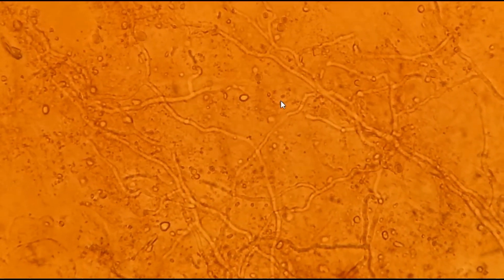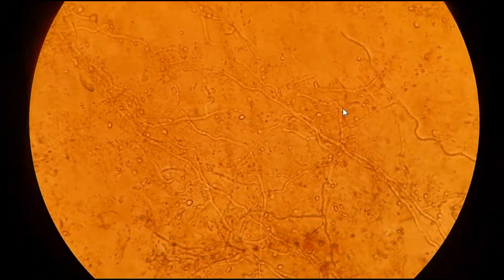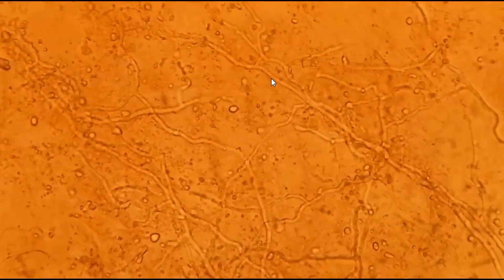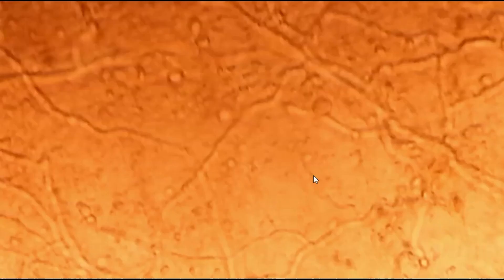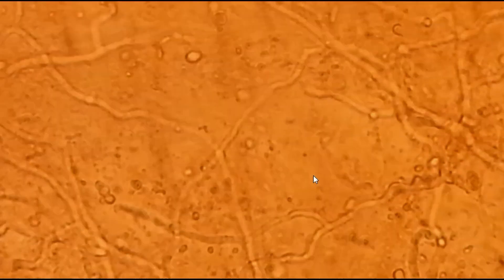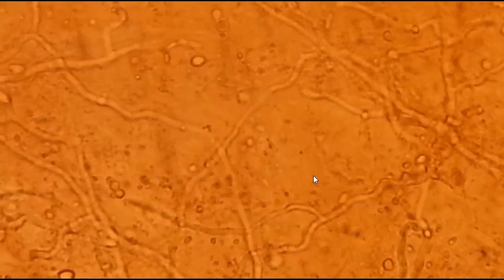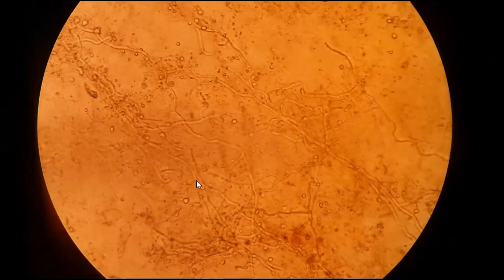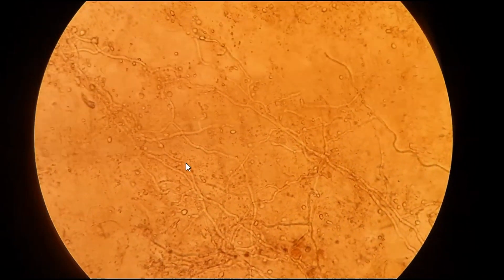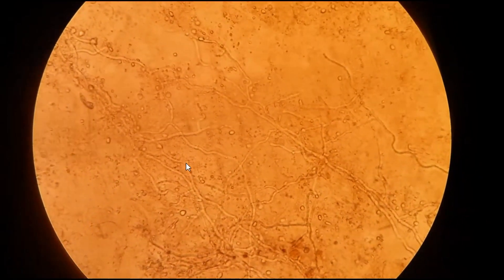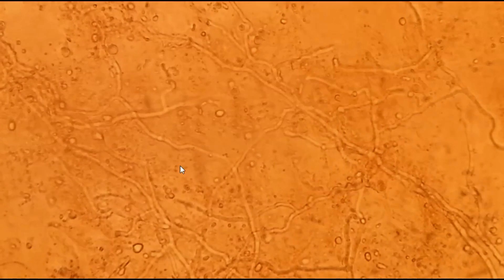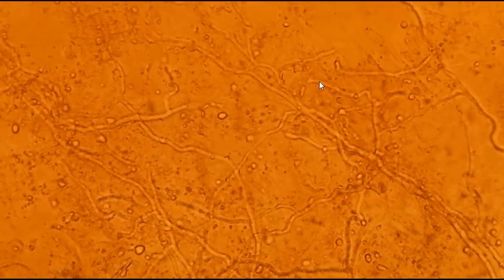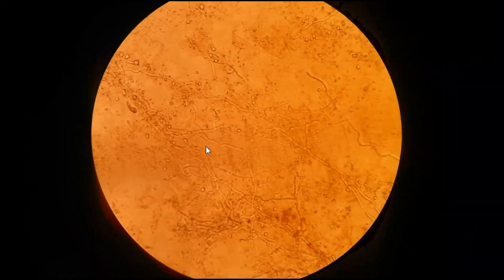The singular form is 'hypha' whereas the plural form is 'hyphae.' Here you can see branching hyphae.